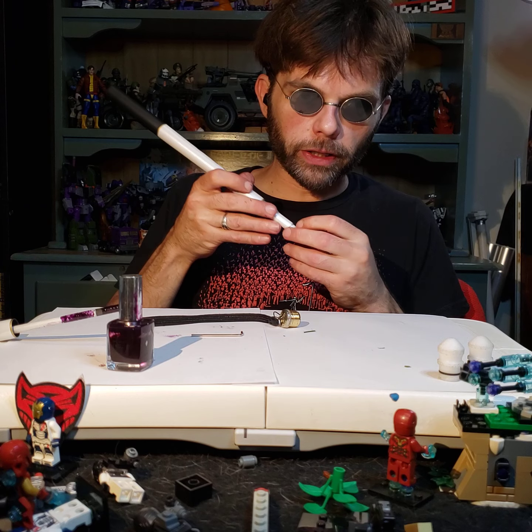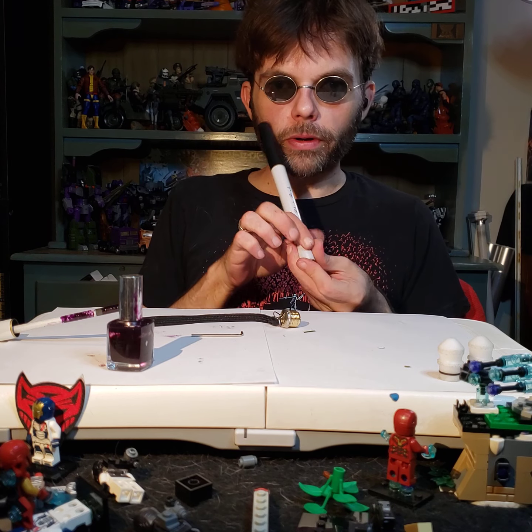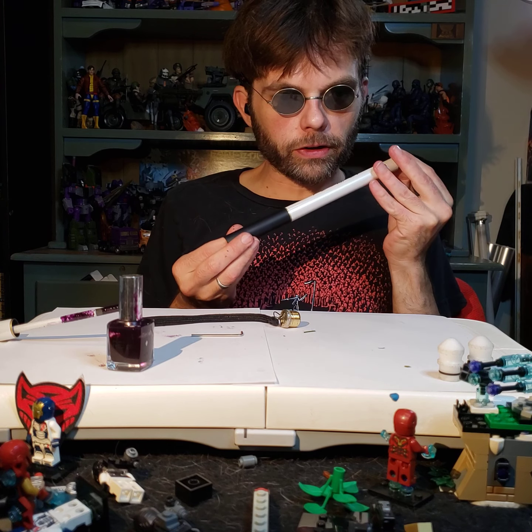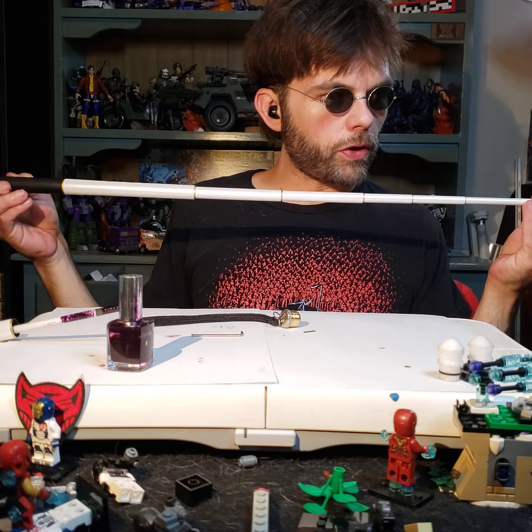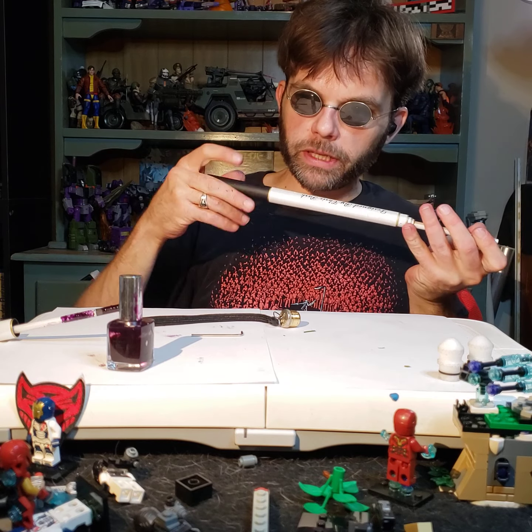Okay, so we're going to pull them all out, and you're not wanting to go in. Okay, let's push it. You just need to give it a good shove. Maybe I made it too thick. We're going to know in a second. All right, there we go. Come on, you stupid pieces.